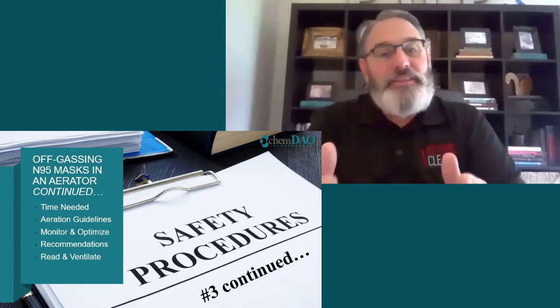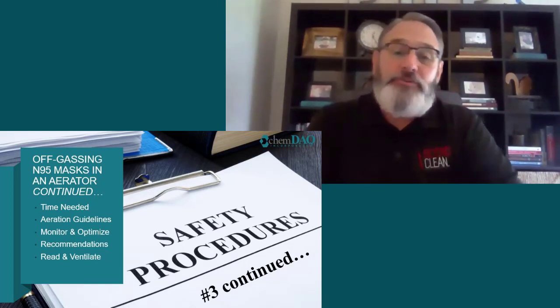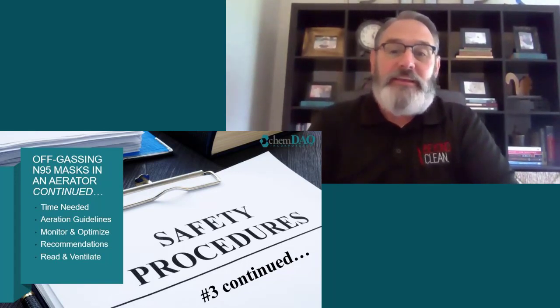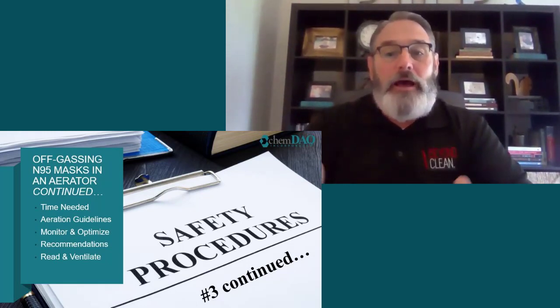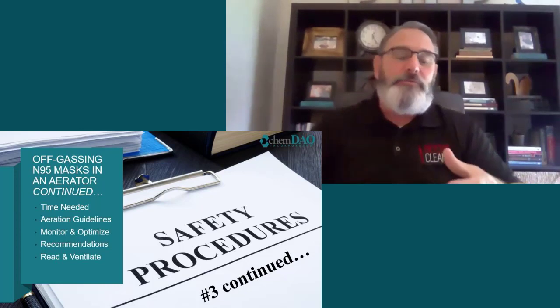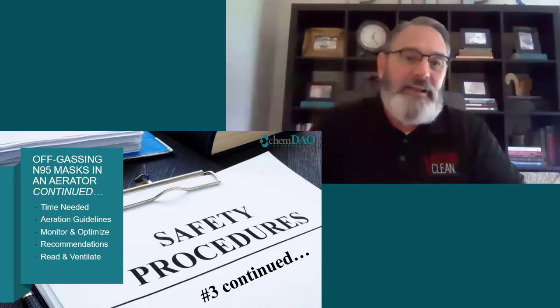So one question that is most certainly going to come up as sterile processing professionals interact with this information: as they run these masks that are contaminated with COVID-19 and have been disinfected in their Sterrad or their V-PRO, do they need to re-clean the sterilizer before they begin running their regular loads again? There are devices like batteries and light cords and cameras and things like that they're typically running every day.